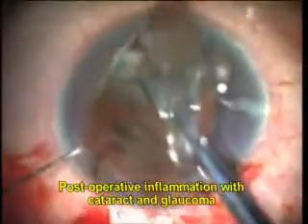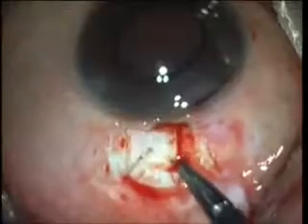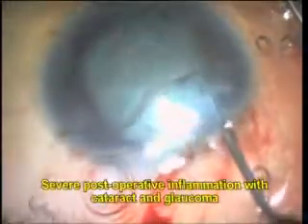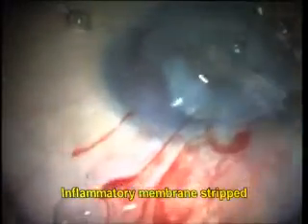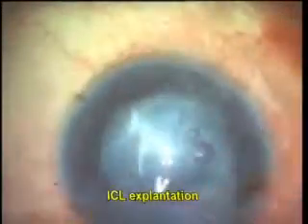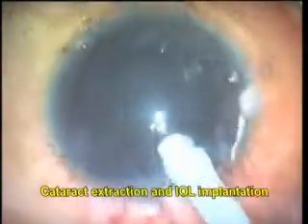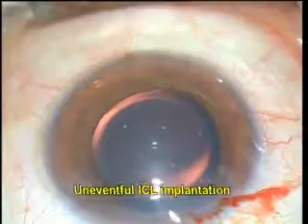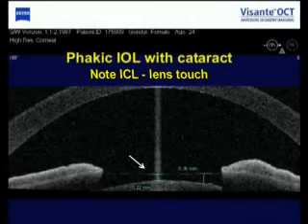Post-operative inflammation may lead to glaucoma, which might require a trabeculectomy, and the cataract can usually be removed easily. Neglected cases can present with severe post-operative inflammation, glaucoma, and cataract formation. It is therefore generally advisable to explant the ICL before such severe post-operative complications occur. Patients may also present sometimes with a delayed onset cataract.